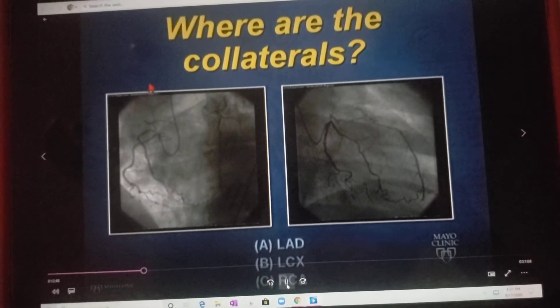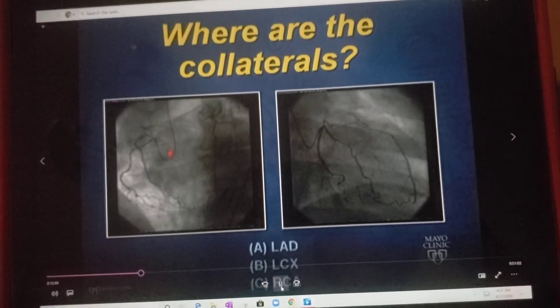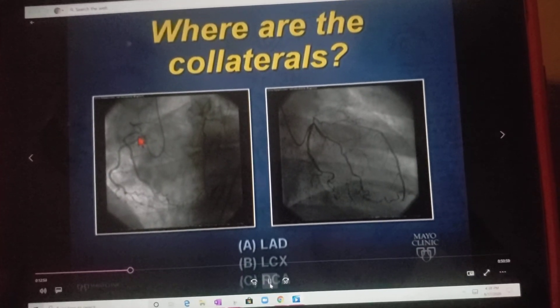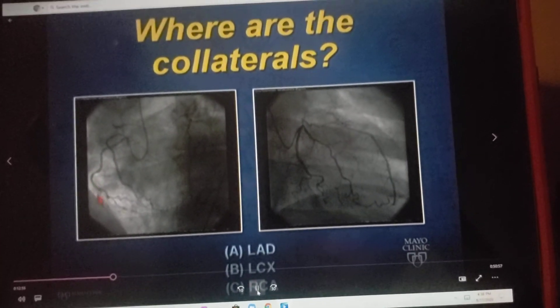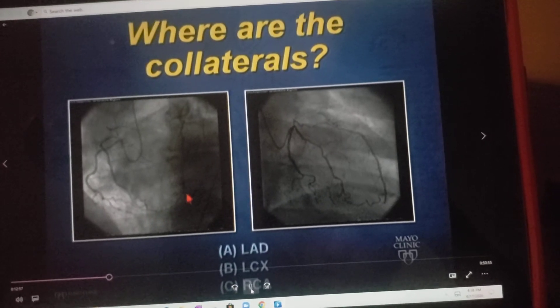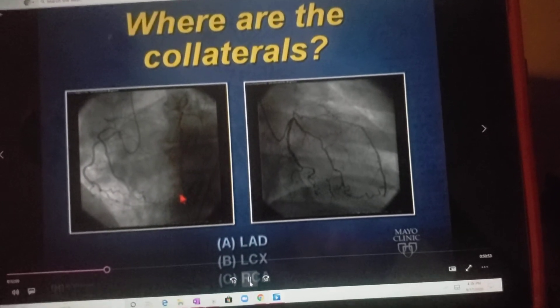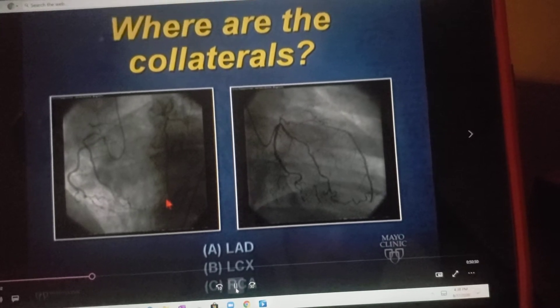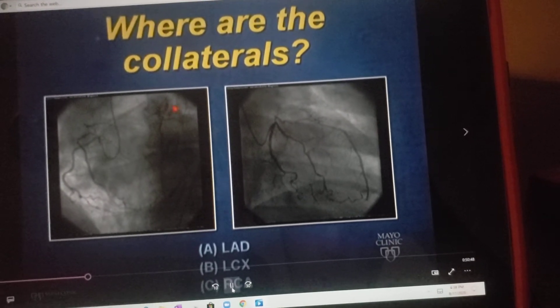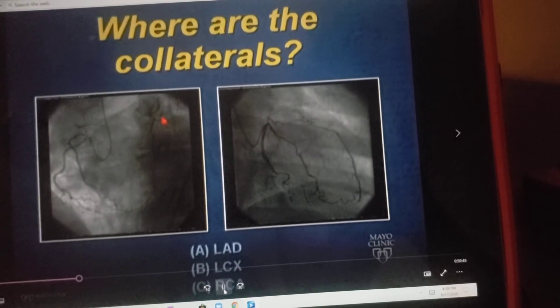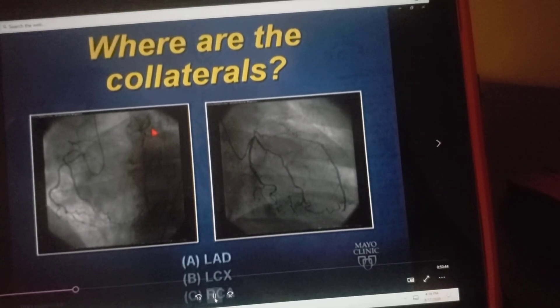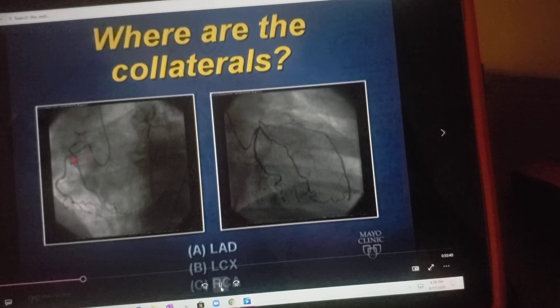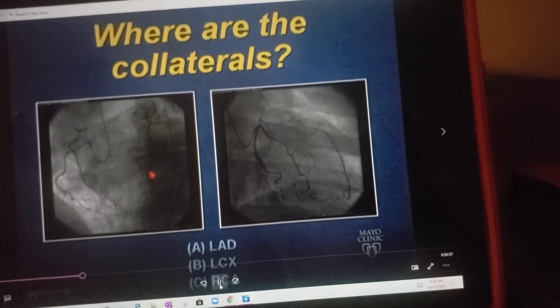So the first step here: the catheter is being pointed towards the patient's anatomic right. It's engaged in the right coronary artery and there are some collaterals here coming across to this vessel. So you want to know where is that vessel coming from? This is L.A.O., so this is the anterior septum. This anterior septal vessel must be the L.A.D. So these collaterals are coming over to the L.A.D.